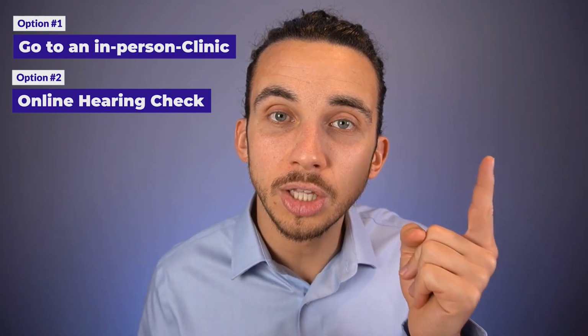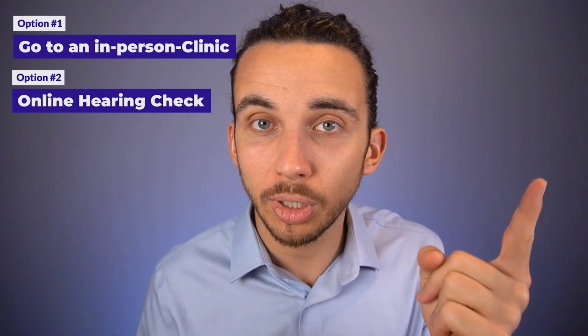Option number two, try an online hearing check first to see where your levels are at. I'm going to put our online hearing check from Treble Health, which is a trusted hearing screening. You can click that link to take the test yourself. It takes about 5 minutes, or you can check the description below this video. Based on the objective test information you have of where your hearing stands in each ear, at what level, bass, mids, and treble, then we're going to recommend certain features, certain settings. You can actually program the AirPods Pro based on a hearing loss. And if you need help with that, please reach out to one of our professionals. We'd be glad to guide you through the process to get the most of the AirPods Pro.